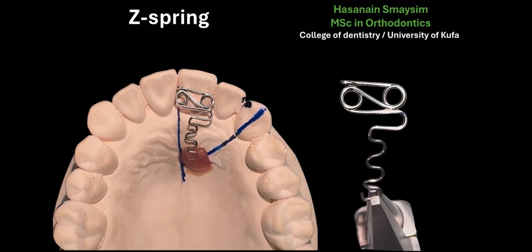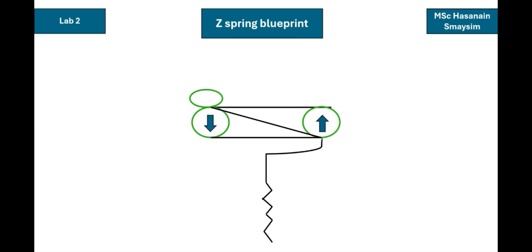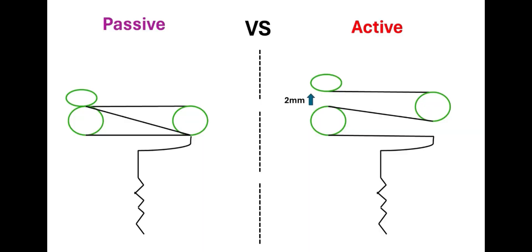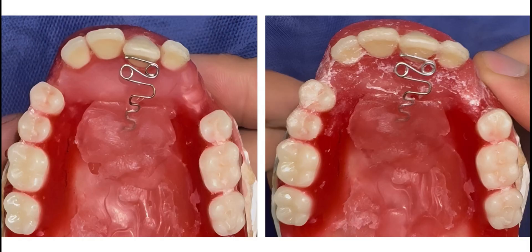Our topic today is the Z Spring. First, I'm going to show you a design animation for the Z Spring, and then a hands-on wire bending, then a demonstration and animation for the activation of the Z Spring, and lastly a simulation of the Z Spring action on a wax cast.